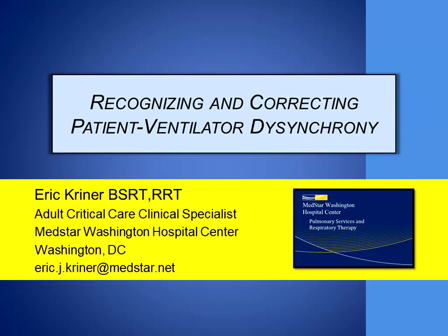So I think as you consider everything and all the changes and how we can kind of organize this, I presented how to correct this in the mode that you're living in and operating in, essentially. If the patient has widely variable flow, clearly using VCAC where the flow is limited may not be advantageous, and so then you have to contemplate switching over to a pressure-limited mode where the flow is variable. However, I will say this, is that although that can be a really good alternative, just switching to a variable flow, pressure-limited ventilation, that in and of itself doesn't fix the problem.